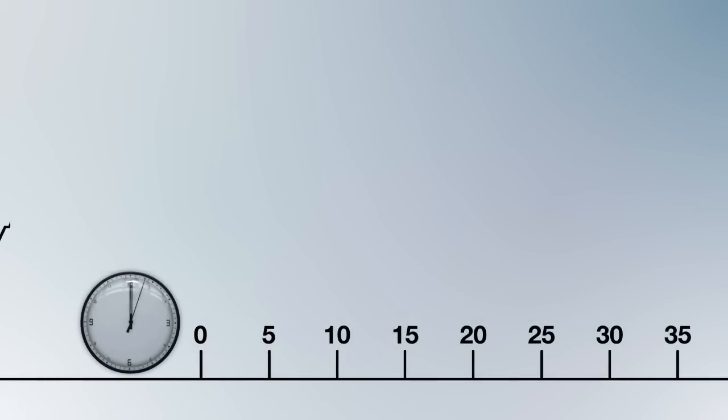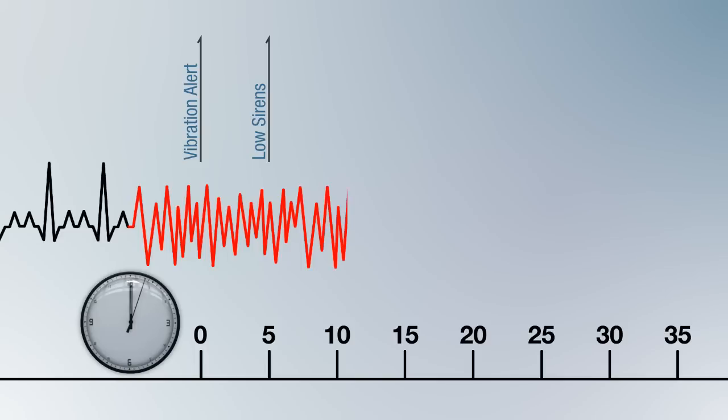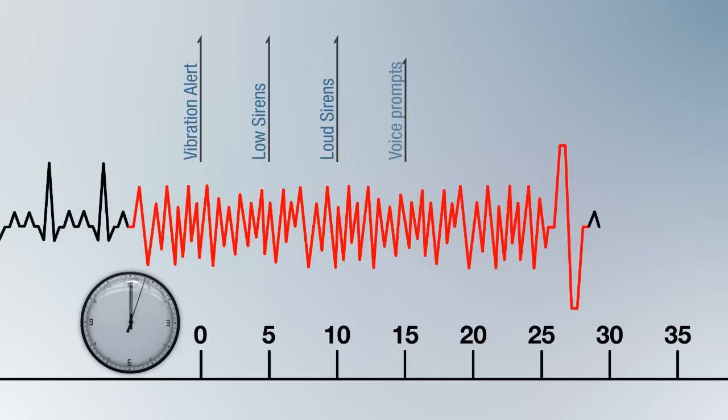If, however, the patient is unconscious, the sequence will run through a 5-second vibration alert, followed by a low single-tone siren, which is broadcast for 5 seconds, followed by 5 seconds of loud 2-tone sirens. The device then transitions to voice prompts accompanying the 2-tone siren.